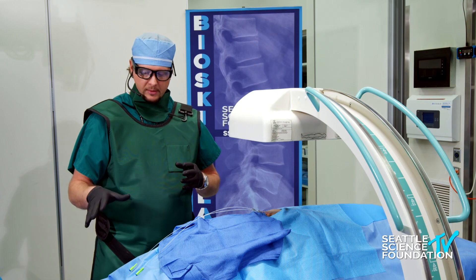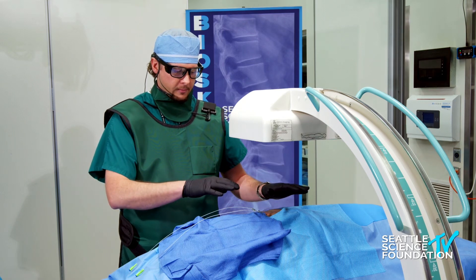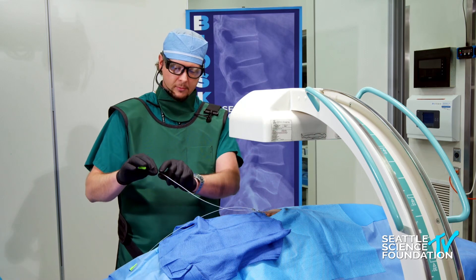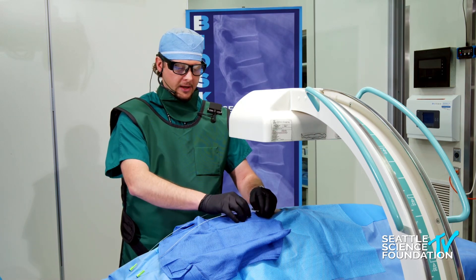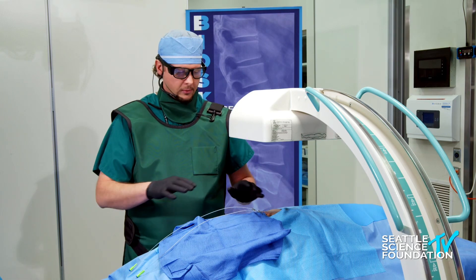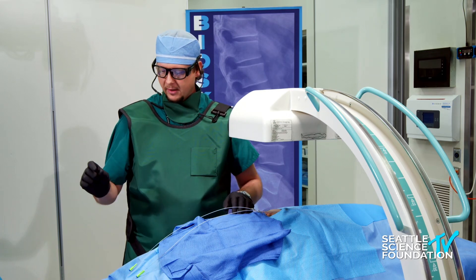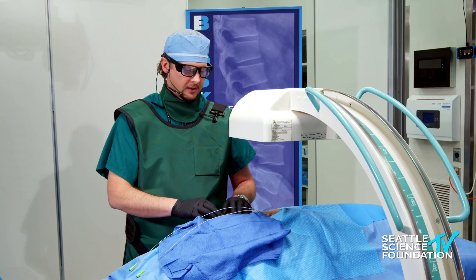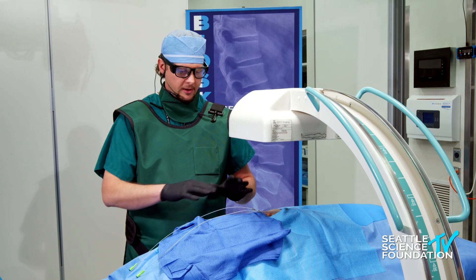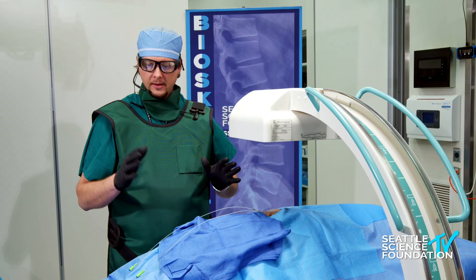Once the stimulation is good, you can go ahead and remove the stylettes and confirm placement hasn't moved too much — because the stylet is rigid and has that curvature at the end. Then go ahead and remove the needle, making sure you're not disturbing the leads. There are different ways to secure leads: more traditional is using a little anchor device with sutures. Then re-hook up the stimulator, package everything up, and initiate your trial. That's the quick and dirty of it.